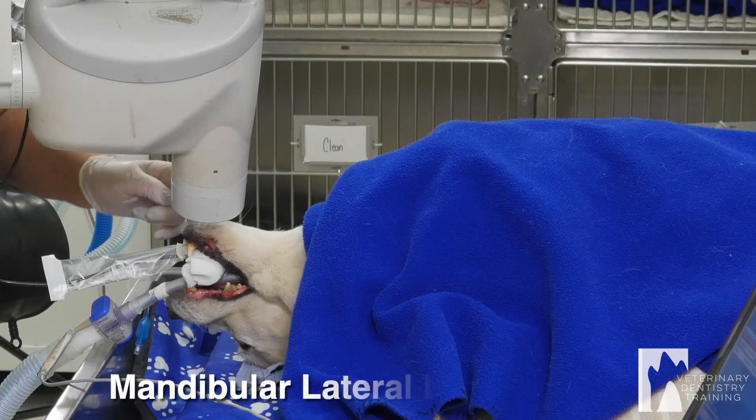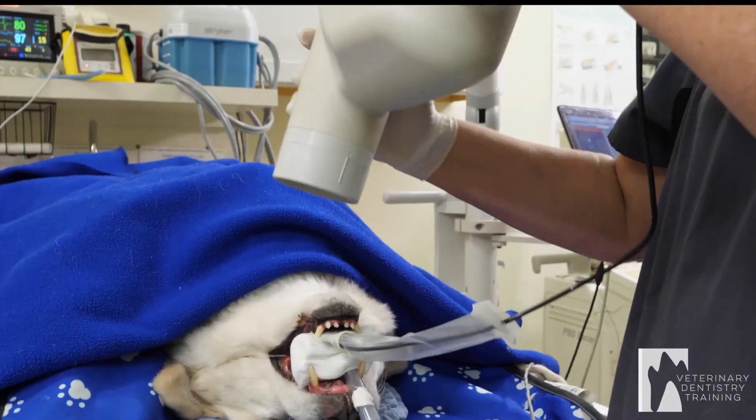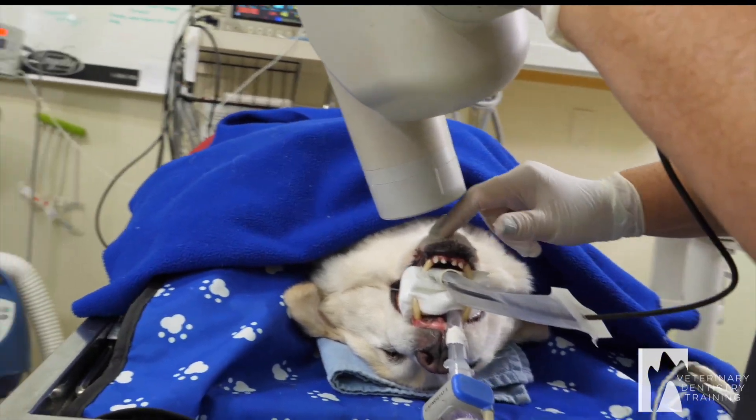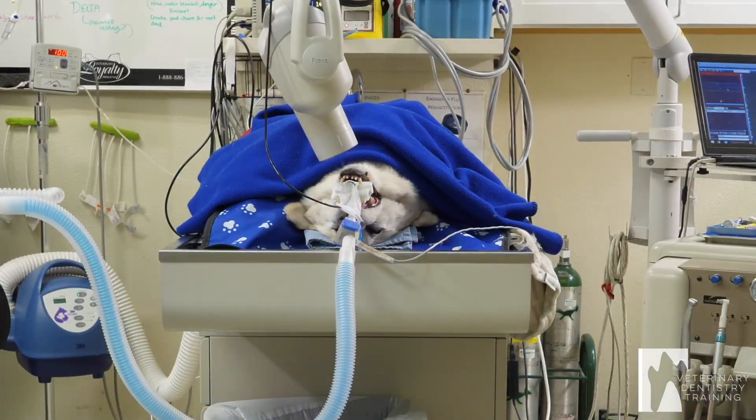Now I'm going to do a lateral left canine. The sensor stays where it is. I just come from the side a little bit like that, centering right there. X-ray.